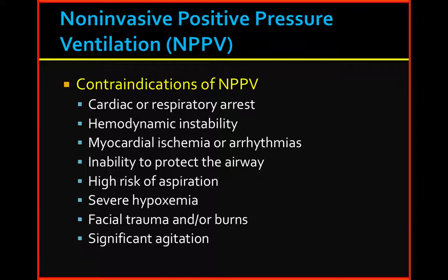You obtain an arterial blood gas on a different patient. pH of 7.4, PaCO2 of 40, and PaO2 of 40. What is this blood gas showing us? At 7.4, the pH is neutral. Next, we look at the carbon dioxide level, 40, which is normal and acceptable, particularly since our pH is normal.